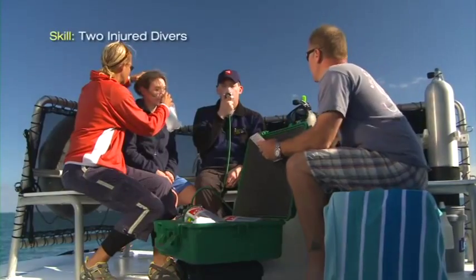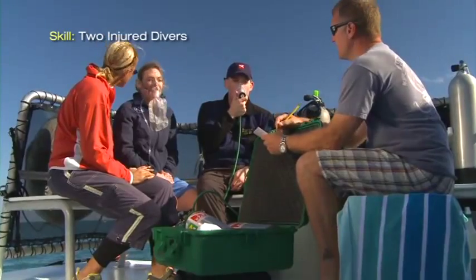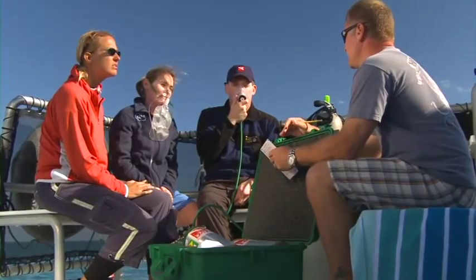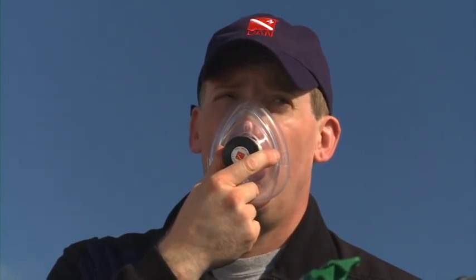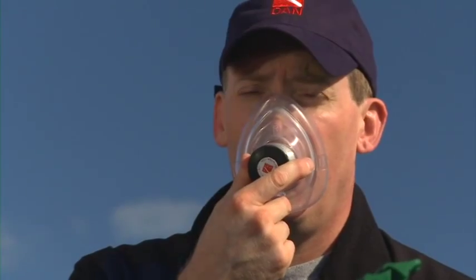Another situation you may encounter is providing oxygen first aid to two injured divers. Your first course of action is to determine which diver has the most serious warning signs and provide the highest concentration of oxygen possible. If the most seriously injured diver is breathing, you'll use the demand inhalator valve; if not, use the oronasal resuscitation mask with supplemental oxygen. On the second injured diver, deploy the non-rebreather mask. Remember to provide the highest concentration of oxygen to the diver with the most serious condition.